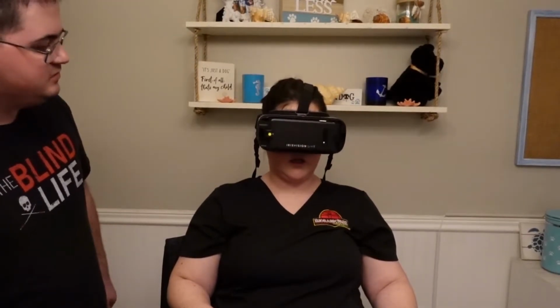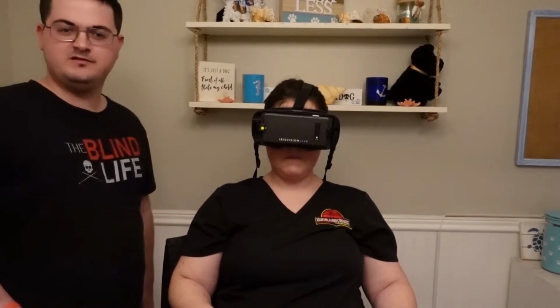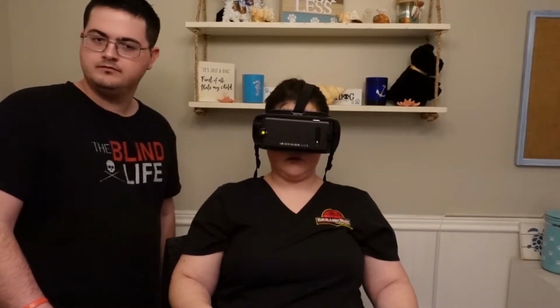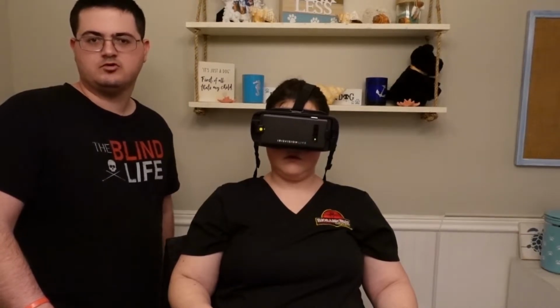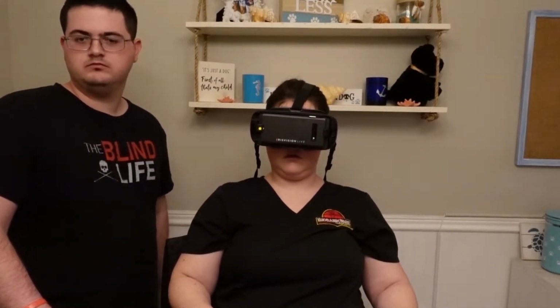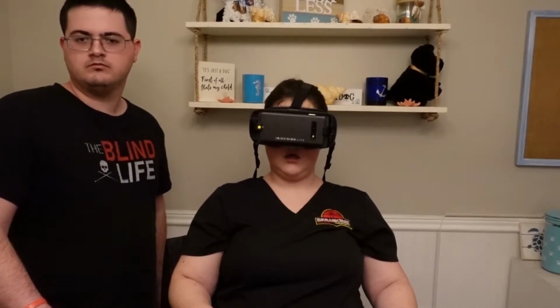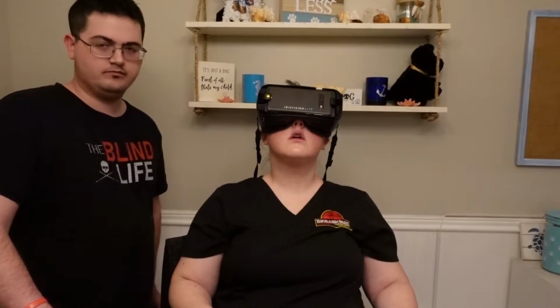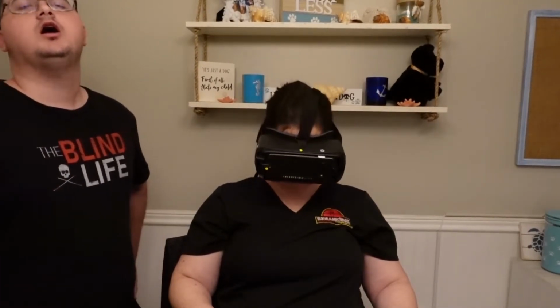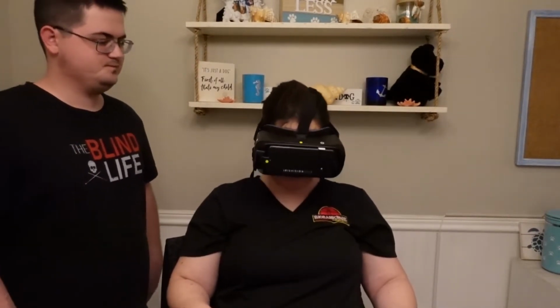Gotcha. I think that's interesting. I think that takes the actual view that it would see right out of the camera, and it takes a portion that you are directly looking at in the center and magnifies that. It might help if you're playing cards or something. Oh, true. Or doing schoolwork or something.